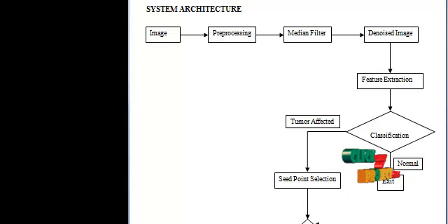In the first step of the region growing, the seed point is selected. The seed point is selected based on the user criteria. The initial region begins at the exact location of the seeds. The regions are then grown from the seed points to the adjacent points depending on the region membership criterion. The criterion can be, for example, the pixel intensity, gray level texture or color.